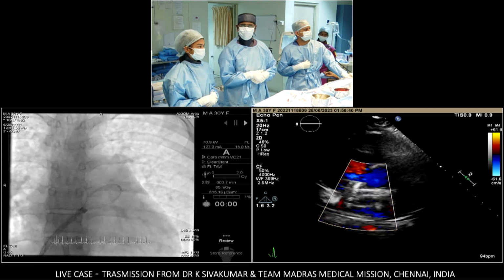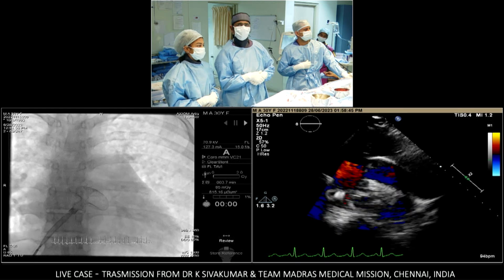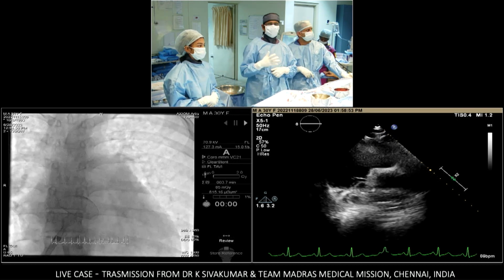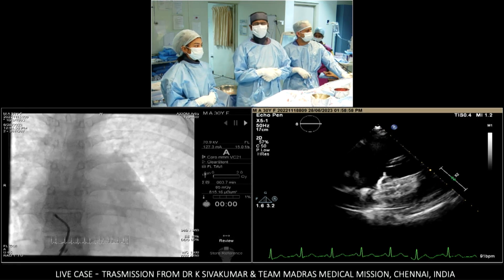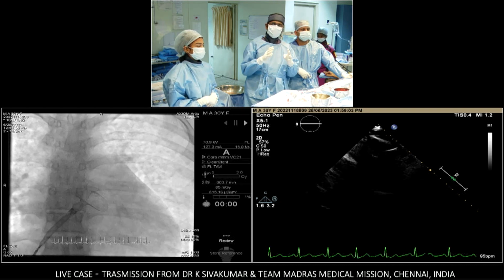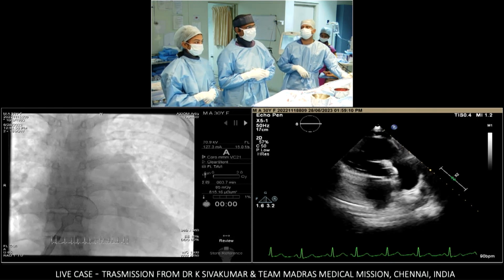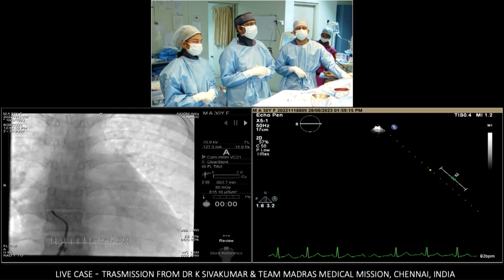So you mean because this is a spiral septum, the septum primum would center itself in one waist and the secundum in the other waist? Somewhere in a spiral fashion along the waist of the device also? Somewhere like that. I think we probably should not read too much science into this differential waist. It is a way of reducing the number of devices in the inventory. That's it. Also, Shiva, the way you deployed it, it's going to be very difficult to have exact positioning of whichever waist you wanted. Is that correct?